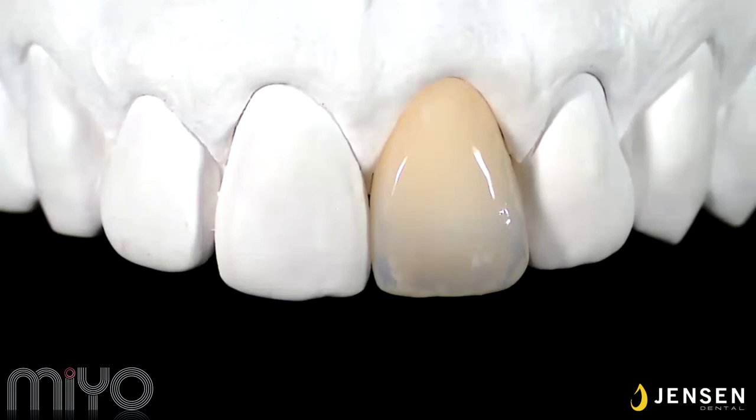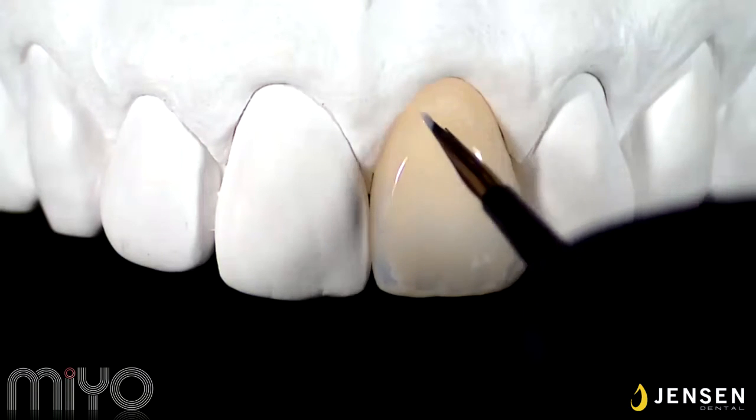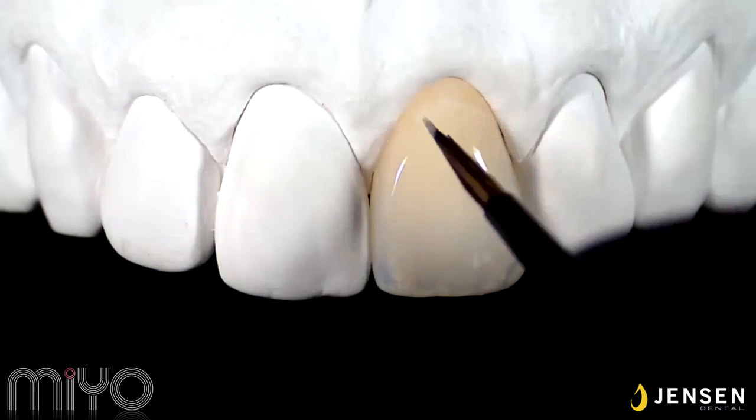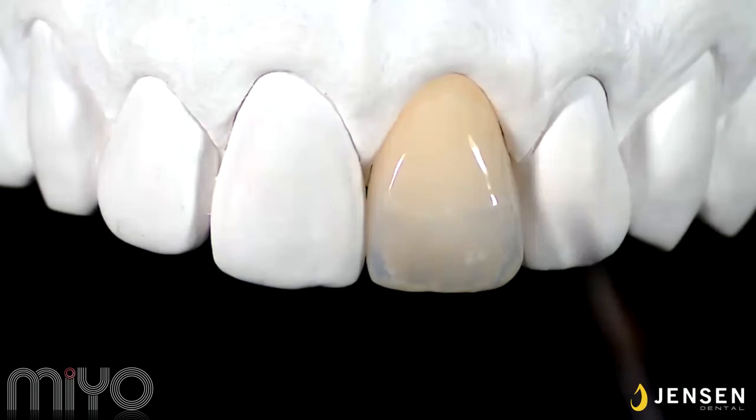Stained snow is applied, which is pure white, to create a value difference near the gingiva region to slightly bump up the contrast and value. I personally like to add some translucent bands or spots, but be careful not to go too intense. Being subtle is the most important thing next to contrast. Create a subtle barrier and add some spots to achieve the depth that you're looking for.